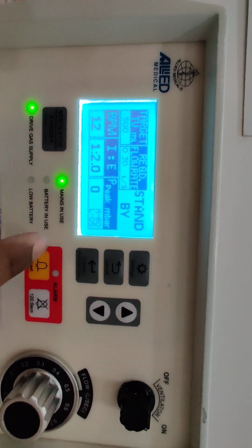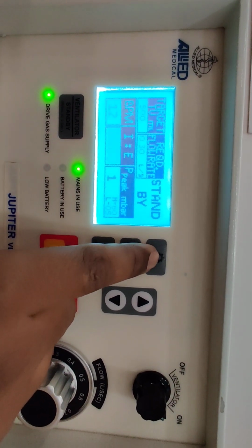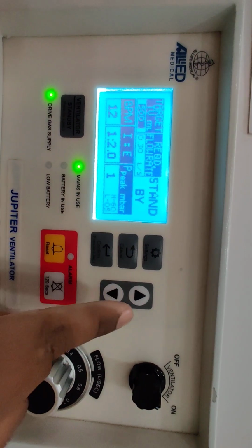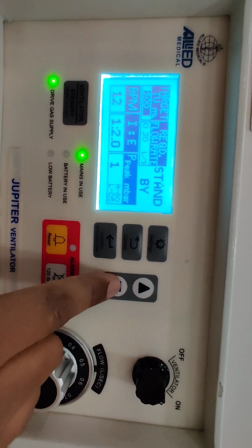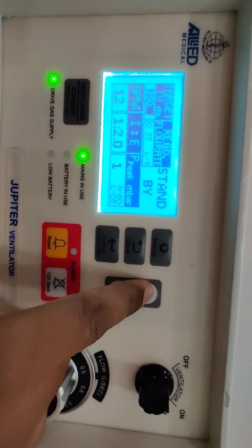For doing the several settings of the parameters, you have to press this settings button over here. Whenever the corresponding parameter gets highlighted, you can change this parameter. You can increase or decrease with the help of these increase and decrease buttons over here like this.